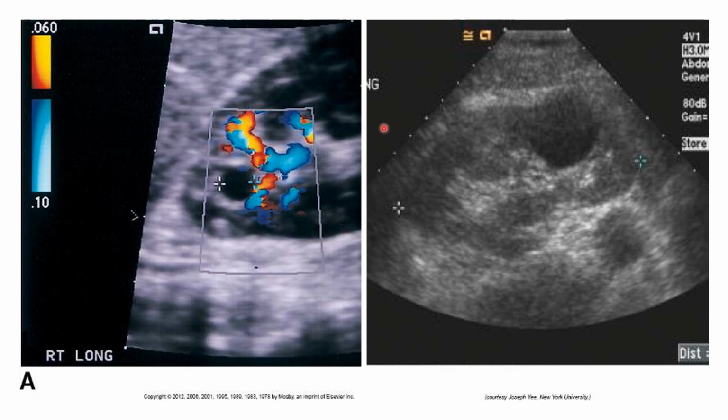Over here, we've got an older image, so the resolution's not quite as clear as it could be, but we've got our kidney right here. And here in the anterior lower pole, we have a rather large cyst. These internal echoes are most likely artifact. Typically, this looks like it's probably a simple cyst as well, with posterior acoustic enhancement.